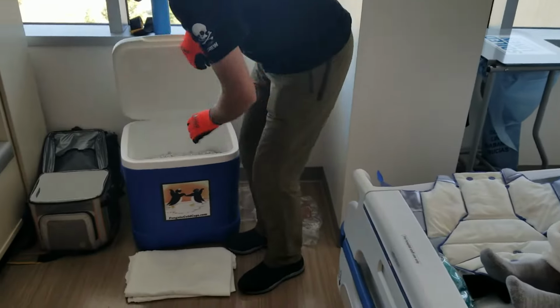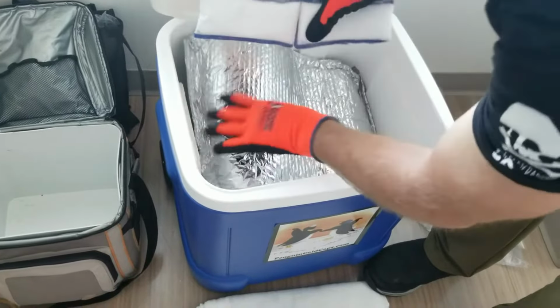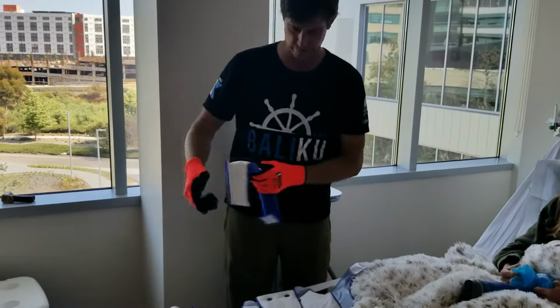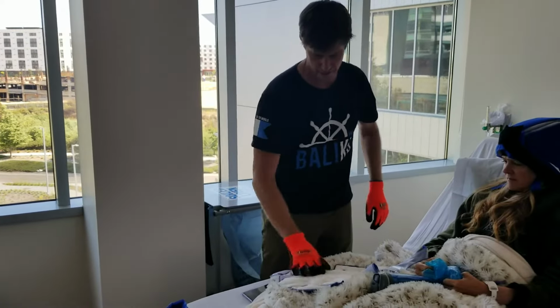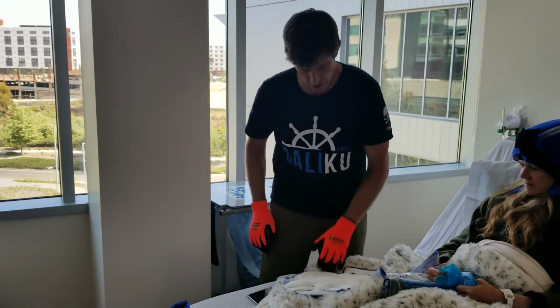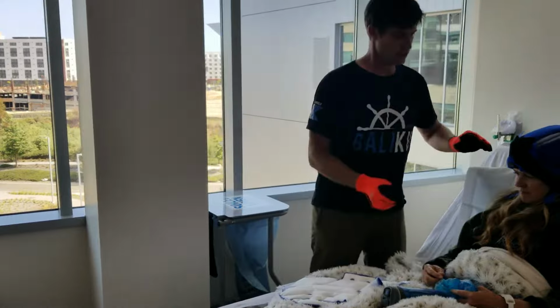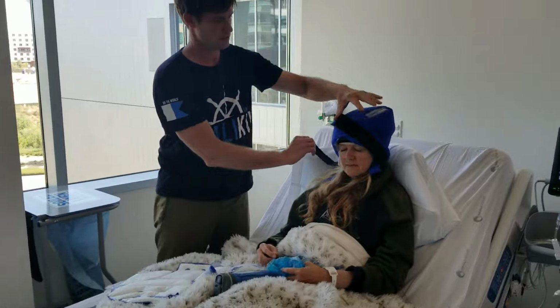The bands are critical. I've got the bands in here on ice. I'm going to pull a really cold one out. I'm not even going to check that, because the bands are usually at a lower temperature anyway, so they're always fairly good. All right, I'm prepping the cap. You want to make sure you don't have any extra frost on here, because that frost can turn into water, and if it heats up you don't want them to get wet hair. I don't need the gloves anymore, but you definitely want to use gloves when you go into the cooler.